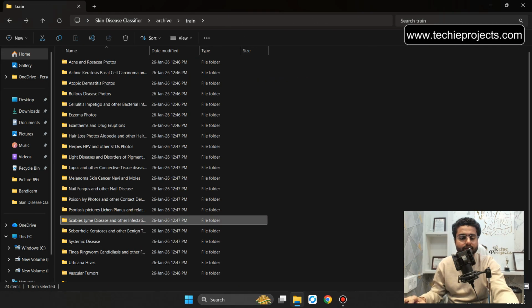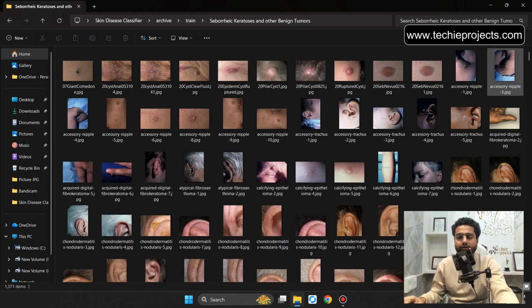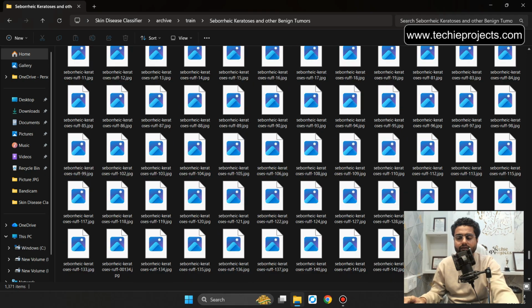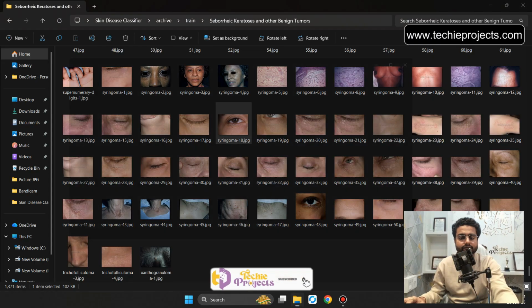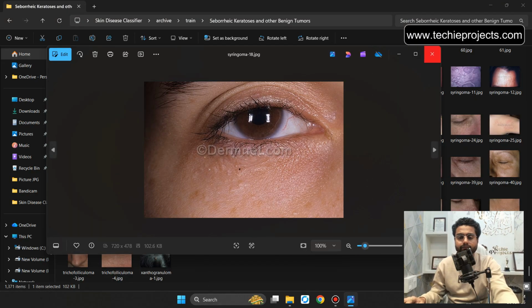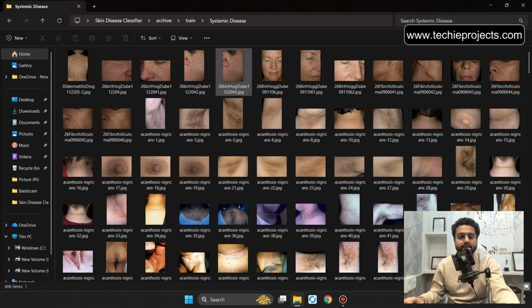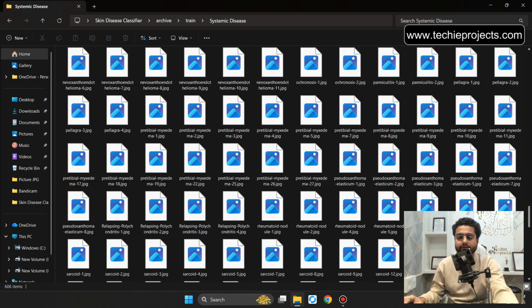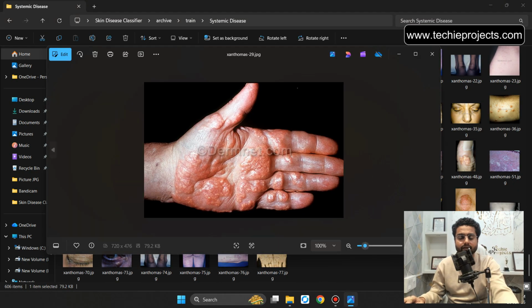Let's go back. Now seborrheic keratoses and other benign tumors. Let's scroll down. It will be around 1371 images. Let's go back. Now it will be the systemic disease. It will be around 606 images. Let's open any of the images. This disease looks like that.